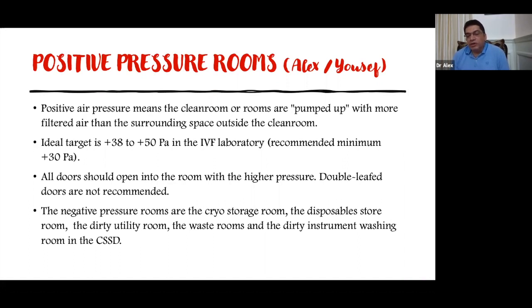And we hear of a lot of incidents of anesthetic gases coming from the operating theater into the IVF lab, detected by many people. This is basically because there is no proper pressure in the IVF lab. There should be a cascading of pressure from the IVF lab towards the OR and the other areas. That has to be kept in mind with proper management of the HVAC system.